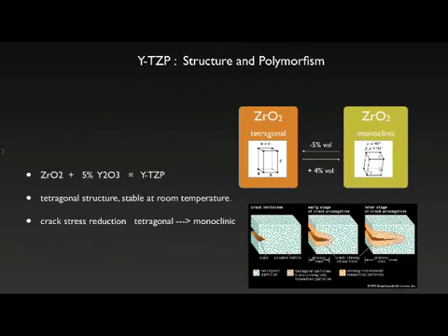As a crack inside that material advances, the tetragonal structure actually shifts phases and becomes more monoclinic, which compresses against the crack and it resists it. That's why the material is so tough and hard, and when we use it as a crown, we have almost crowns that are indestructible and cannot break. And the same thing goes with these implants. They're extremely, extremely strong materials.